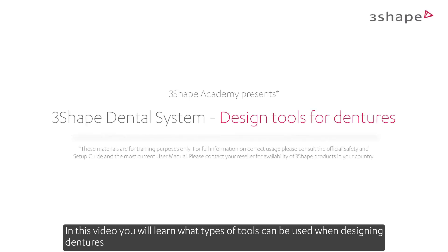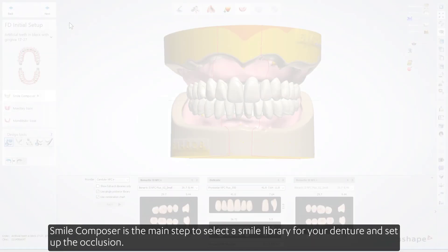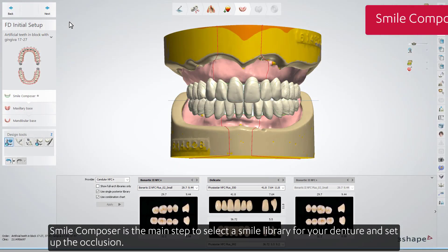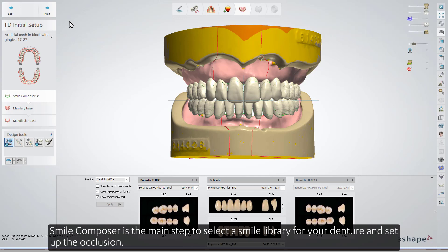In this video you'll learn what types of tools you can use to set up occlusion when designing dentures. Smile Composer is the main step to select a smile library for your denture and set up the occlusion.